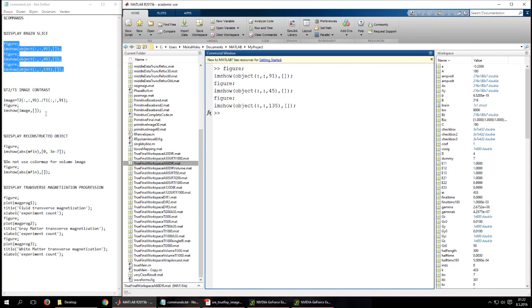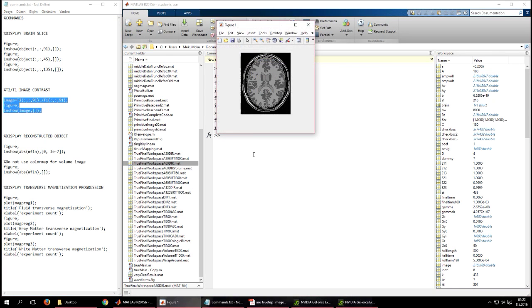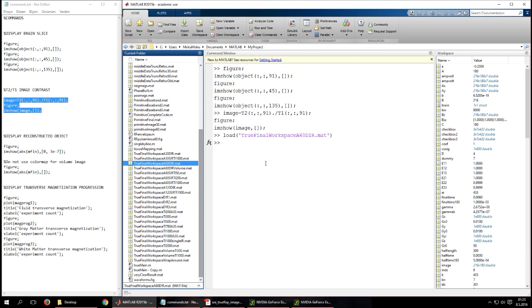To give an idea, this is an image colored by the T2 over T1 ratios of tissues. We see that white matter is the brightest tissue, the fluid is also very bright, and the gray matter is the darkest. But because the fluid has the highest spin density, it will appear as the brightest tissue in double inversion recovery images. Keep in mind that these T1 and T2 values come from the data of the Brain Phantom and do not necessarily reflect the exact reality.